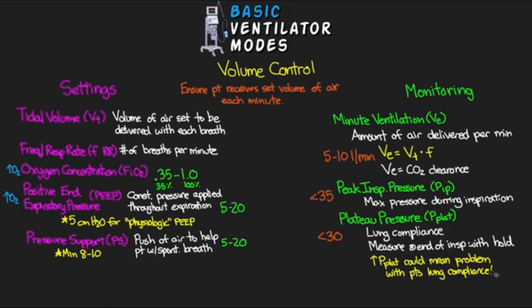And so now let's go ahead and move on and talk about the different volume control modes. I'm going to go through a few different modes that we're going to see here. And it can really help to think about these modes as being from the most supportive to the least supportive in terms of our patient's work of breathing.